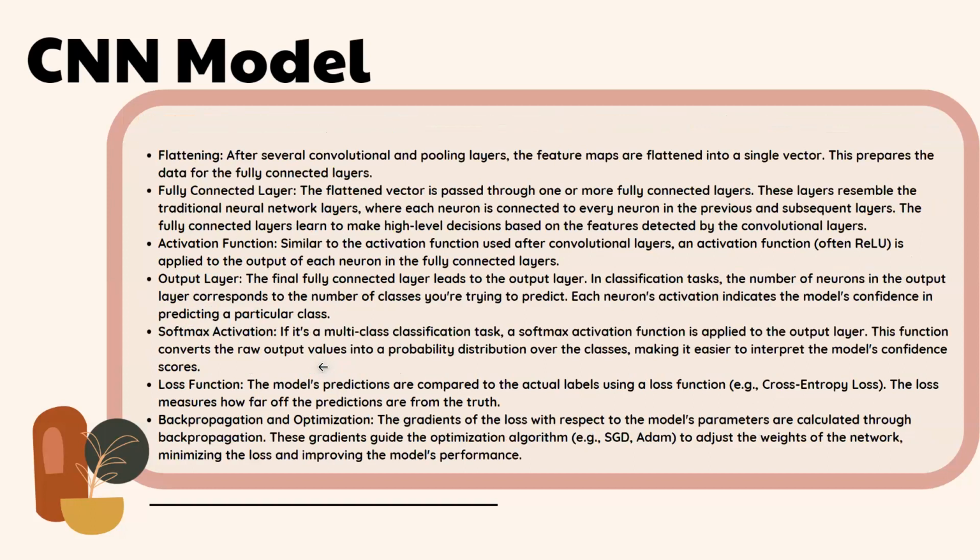Then comes flattening, where the outputs taken from the hidden layers are flattened into a single vector, creating the data for further layers.